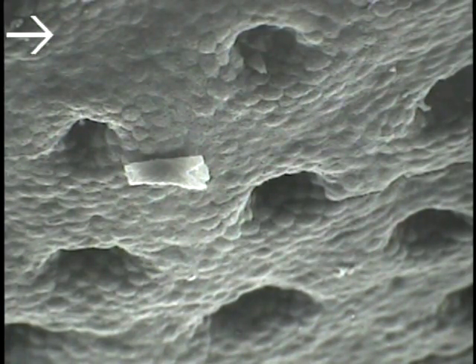This particular illustration is a scanning electron micrograph of the surface of the stomach. We're looking from the luminal surface onto the mucosal surface. This figure illustrates the orifices, or the openings, of the gastric pits. So a gastric pit, the orifice thereof is shown here, one here, one here, one here, one here, one here, and one here, with some exfoliating debris located here.